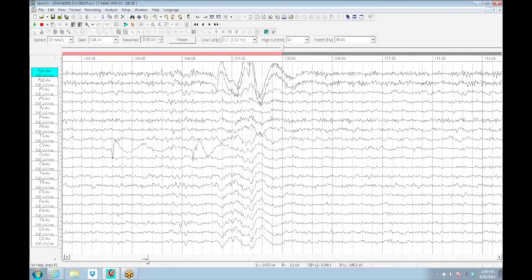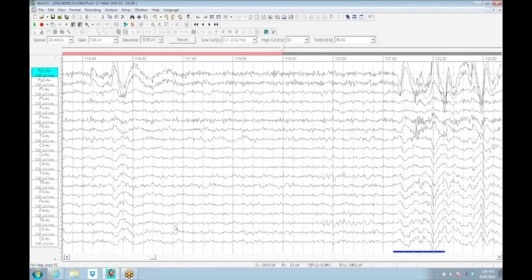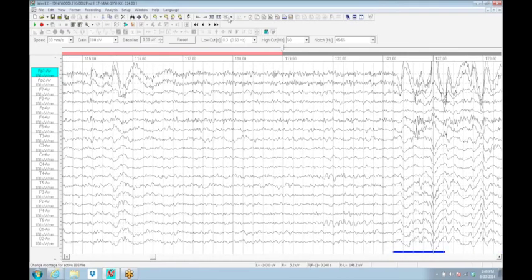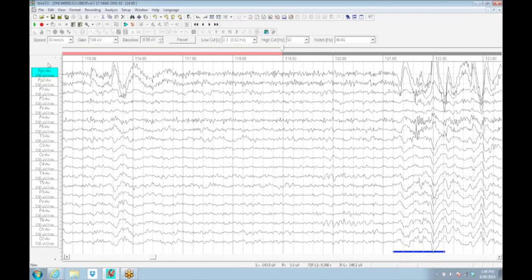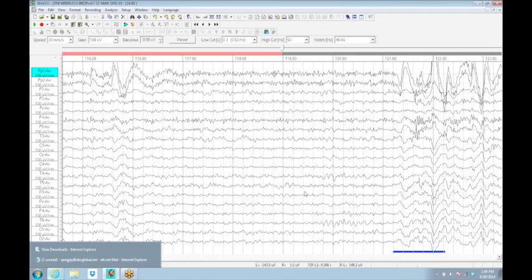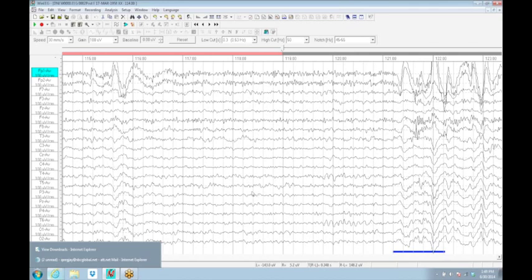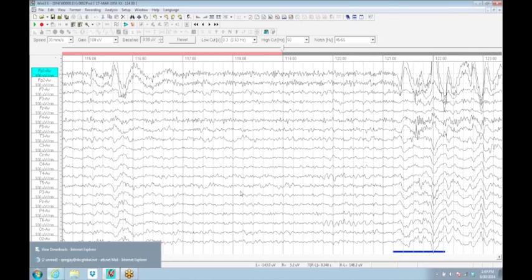The EEG here has remontaging capabilities. It's got EEG frequency filtering capabilities. It's got all sorts of fairly high levels of analysis. You can do manual extraction of chunks and analyze it separately from doing the ICA extraction and compare your results. You can compare results between multiple montages and actually see where things come from fairly well. That's a quick and dirty tutorial on how to kind of get up and running, playing around with the WinEEG software. That's great. We also have a little manual that goes along with this that you can access in your Saybrook documents file.